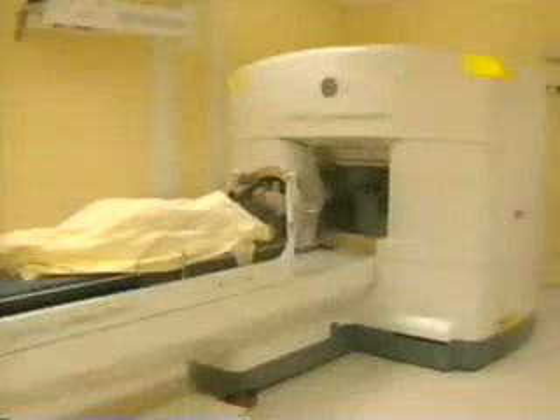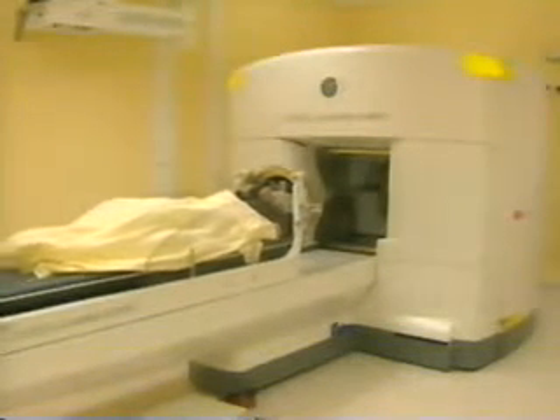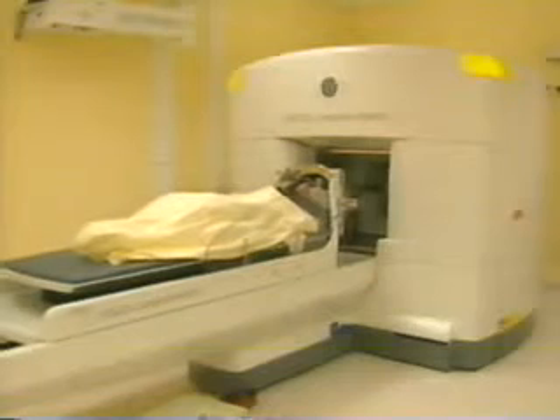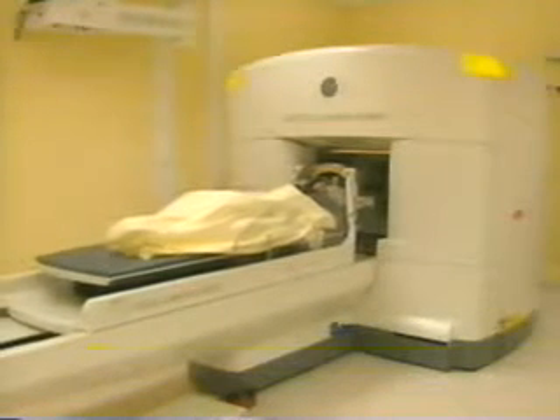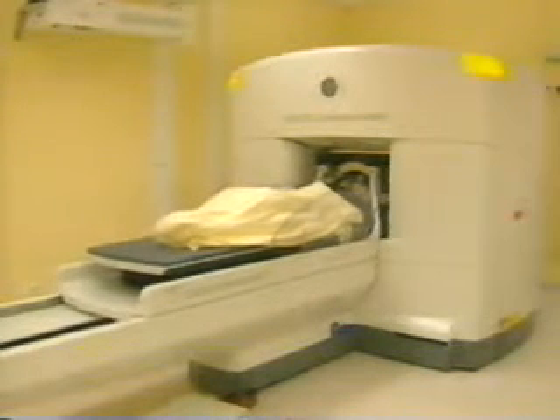This video will describe Gamma Knife Surgery and what you as a patient will experience before, during, and after treatment. Gamma Knife Surgery is a well-established treatment method used to treat selected targets in the brain. Lexel Gamma Knife is not a knife in the normal sense of the word — the doctor makes no incisions in your head, and the treatment is painless. It also allows you to quickly return to your normal routines. More than 30,000 patients undergo Gamma Knife Surgery every year. The method has been in clinical use since 1968, and there are about 200 Lexel Gamma Knife systems in operation around the world.